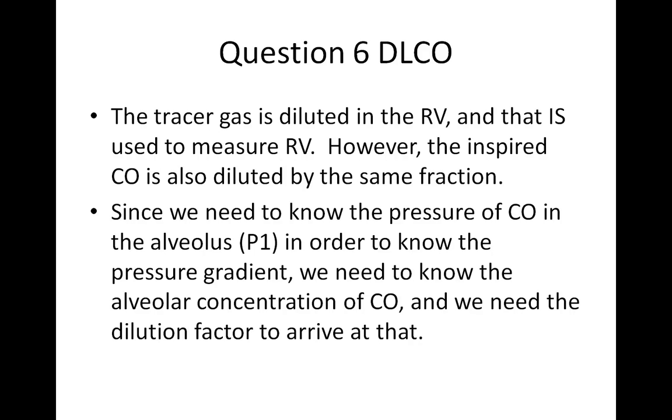We're going to have the patient exhale to residual volume. Then they're going to take a deep breath of that gas mixture, and that gas is going to be diluted by the residual volume. They're going to take a vital capacity breath in, going to total lung capacity, but the tracer gas is going to be diluted, and the carbon monoxide is also going to be diluted.